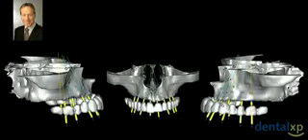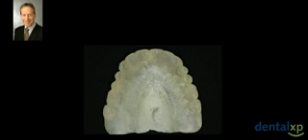But look at the biomechanical concerns. Look at where these teeth need to be, and look where the maxillary bone is. That's a significant biomechanical disadvantage. So the ability to have a discussion with the restorative doctor and the patient and the lab and myself to put responsibilities where they belong occurred prior to the procedure.